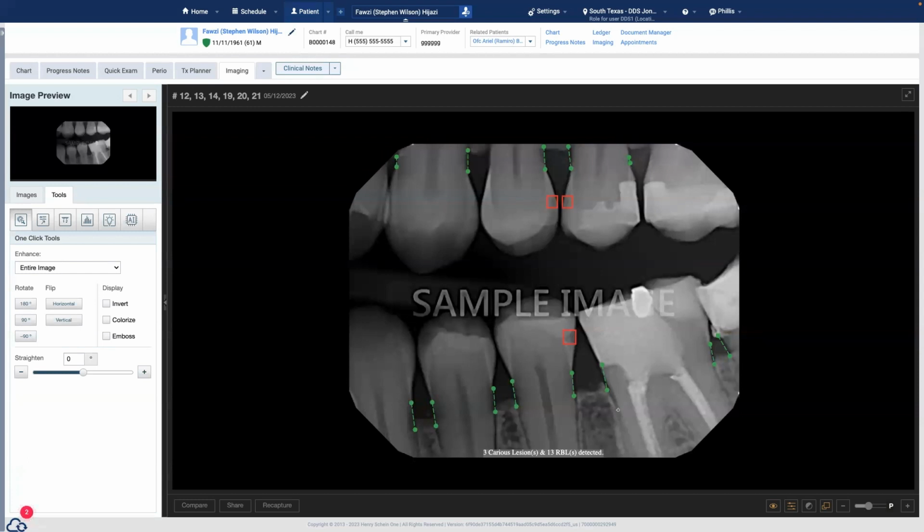You need to do a better job flossing, or you see all this buildup right here, or whatever it may be. Again, I know that's not on the screen, but just hypothetically speaking. I actually have posted some of the X-rays that the AI has picked up. It picks up overhangs on crowns. It picks up cement. It picks up the amount of bone above the collar or below the collar of an implant. It's very comprehensive, and I may actually post some of these X-rays in the group with this video, so people can actually evaluate it.